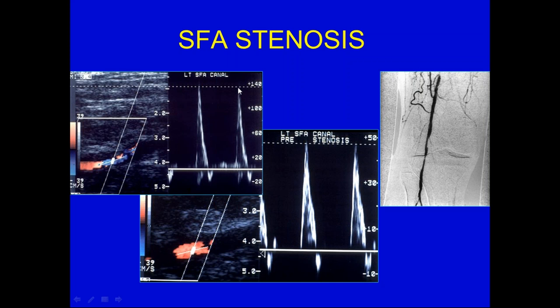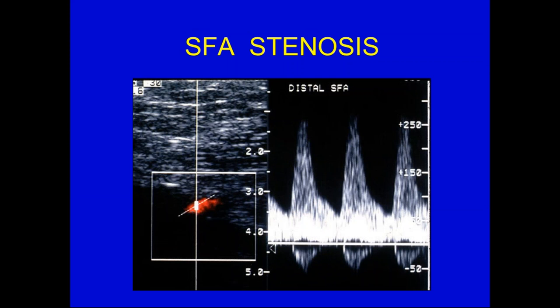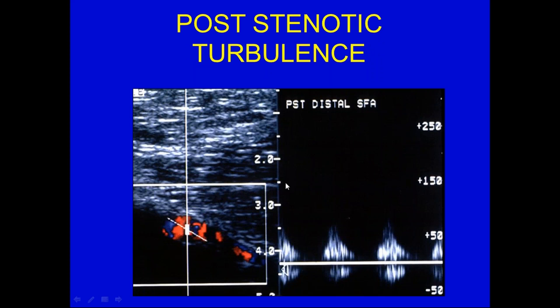Here is another patient in the superficial canal. The pre-stenotic waveform is more of a normal triphasic — so we know there is no rate-limiting stenosis above. The velocity is less than 50, going up to about 140 cm/s — that's greater than 2:1, approaching a 3:1 ratio, a 2.5, indicating a stenosis of greater than 50%. Not every stenosis is going to have post-stenotic turbulence or parvus tardus. Here is a patient with a distal superficial femoral artery — an abnormal waveform and color persistence at the stenosis. Distal to that, there is the parvus tardus abnormality, where the stenosis is so significant it's unable to reproduce the triphasic waveform — typically severe stenosis without diastolic flow and a rounding pattern.